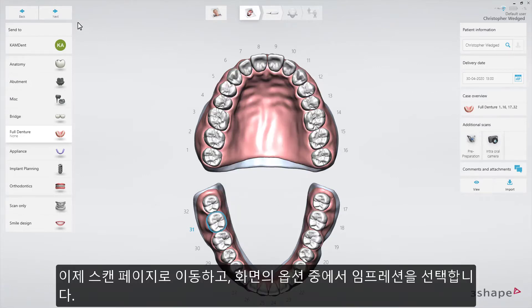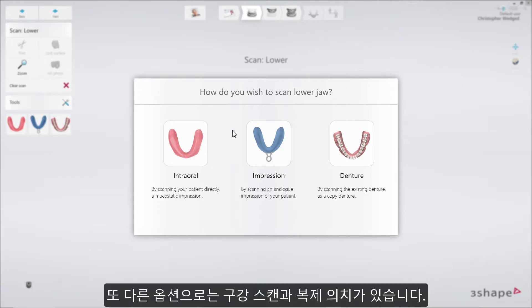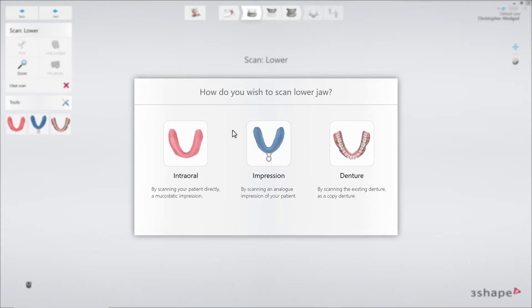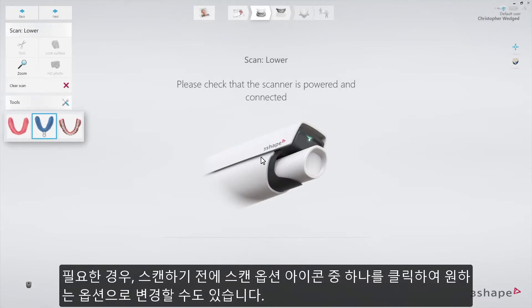Proceed to the scan page and select the preferred scanning option from the pop-out. In our case, we select Impression. The other options are Intraoral Scan and Copy Denture. If needed, the option can be re-selected again before scanning — just click on one of the scanning option icons.